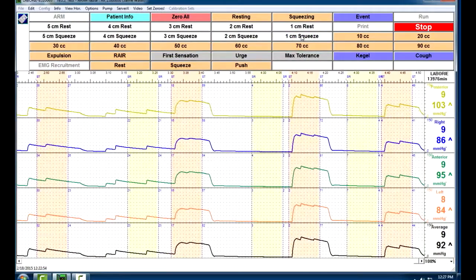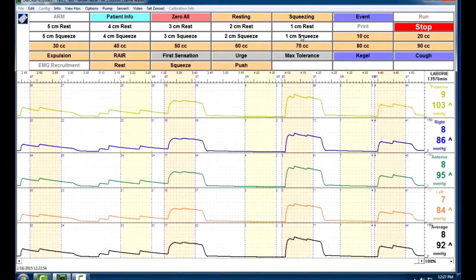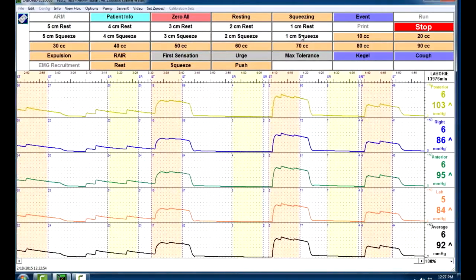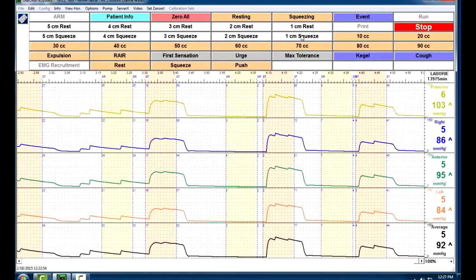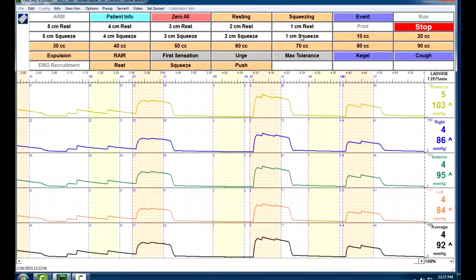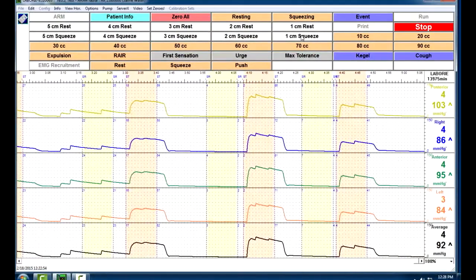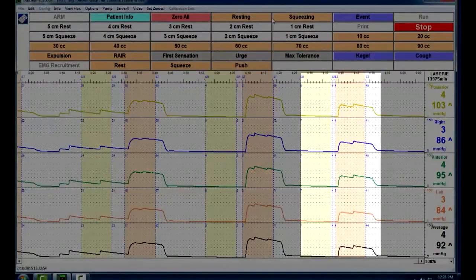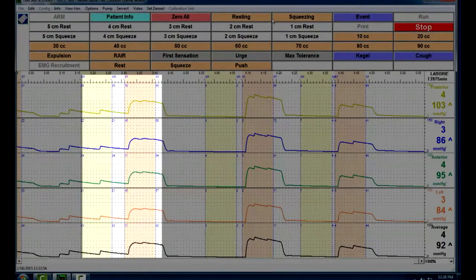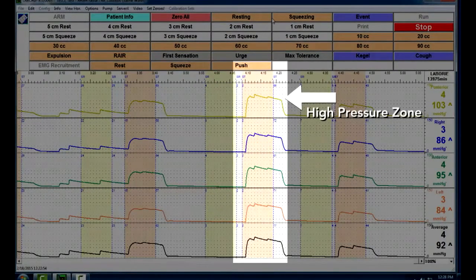Now, while we're doing all this, you have to be aware of what's going on. We want to make sure that you are determining at which location the patient was having the most pressure generated. And if you can see, this first section right here is what we just did. So that's at 1 centimeter. This section here is at the 2 centimeters. This was at the 3 centimeters. So this section right here, section 2, they generated the highest amount of pressure in all the different channels.